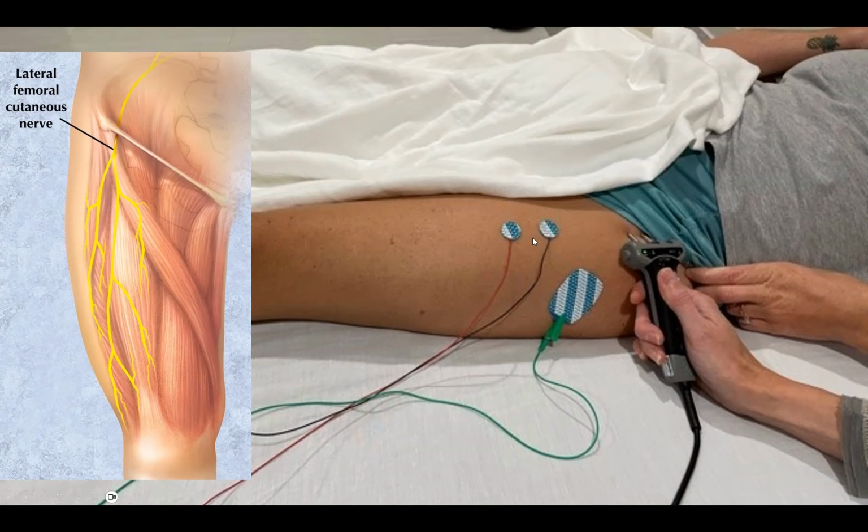And the stimulation and the electrode distance varies from about 10 centimeters to 12 centimeters. I find that 10 centimeters might give a better response. Some textbooks state to place these 12 centimeters. And again, you have to move these electrodes around. Some people will stimulate both underneath the inguinal ligament and then more proximal, although this is technically difficult because you're now getting into the pelvic region and abdomen, and there's more adipose tissue in most patients. So in our laboratory, we only stimulate at the distal site. We're looking for the amplitude or an amplitude change.